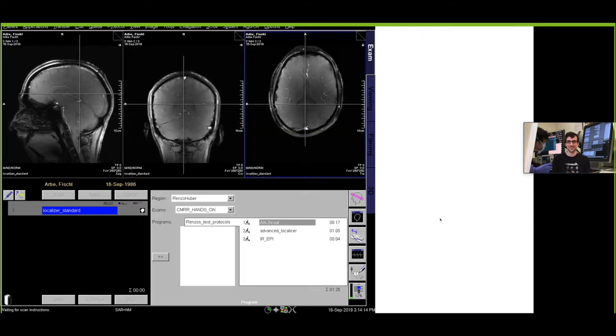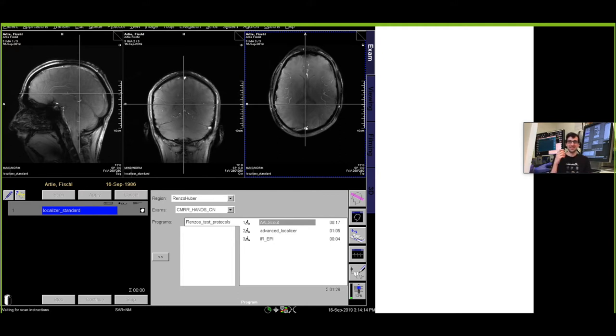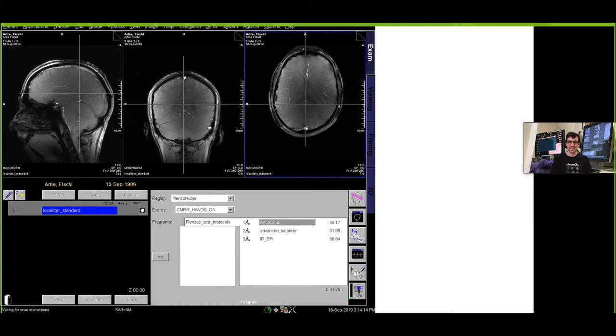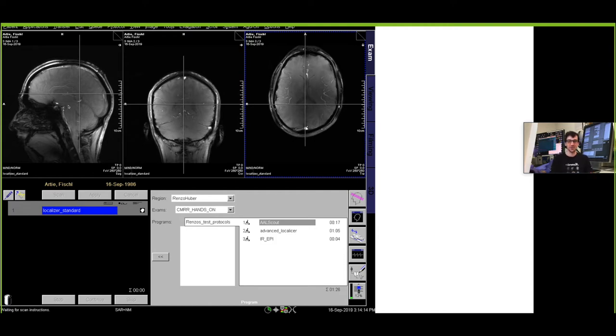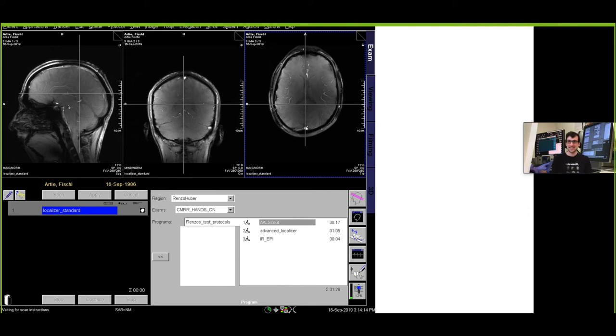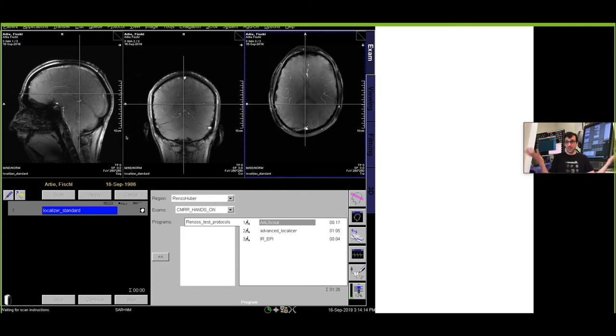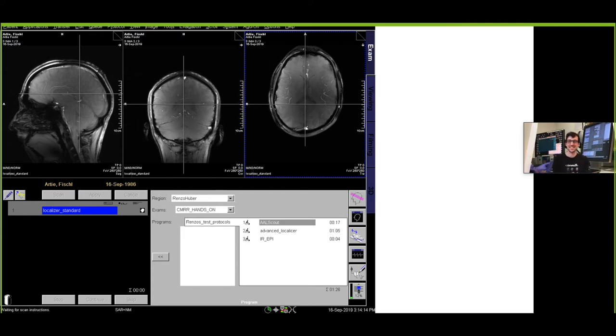So let's start by going through a few steps after the participant, in this case Arty, is on the table. Here we have the standard localizer and I'm mostly showing you results from a classical Magnetom 7T. The standard localizer looks somewhat like that. It is perfect, it's fast for conventional fMRI. We know the edges of the brain so we can place our slices. However, for layer dependent fMRI this is not really good enough.